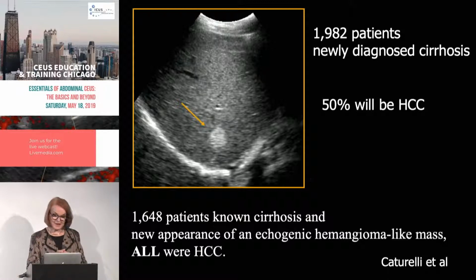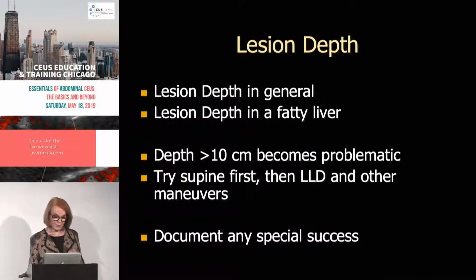And I said, well, I think it is. And so it turned out to be, which was the great thing. But it's been a very helpful rule. I always show that to people because if you're going to do ultrasound with CEUS and you're going to be the person out there deciding, is this a scan I'm going to take to my boss and say, let's do a contrast, you have to know what things you should be looking at. So that's one of them.